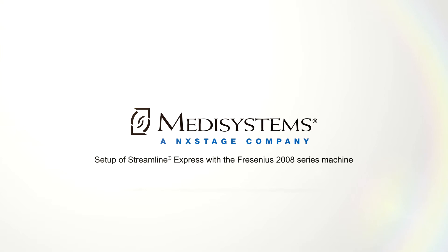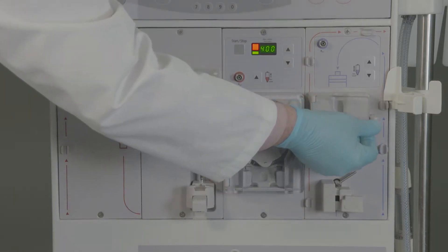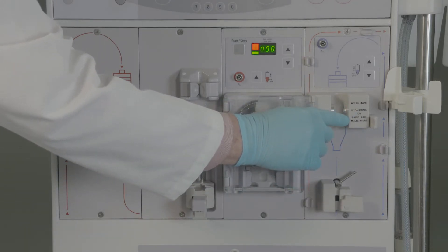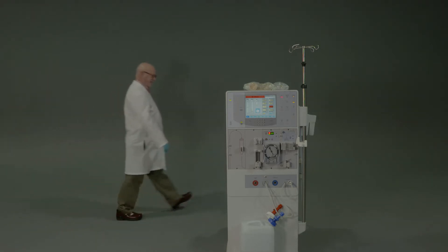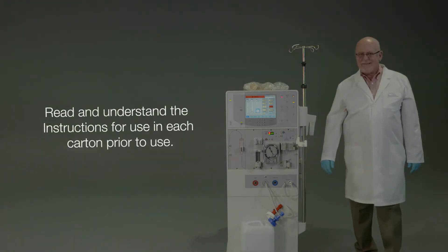Prior to using Streamline Express with the Fresenius 2008 series machine, users must verify the blood pump is configured for 8 mm internal diameter pump segments. Ensure the machine's level detector has been calibrated to the Streamline Express venous chamber. Ensure the machine has been set up with the prime amount method and the prime amount is 300 milliliters minimum. Verify the Streamline dialyzer holder is placed on the upper or lower venous bloodline tubing clip.